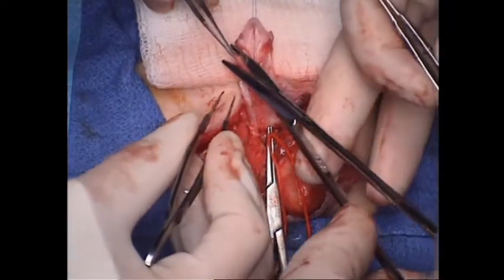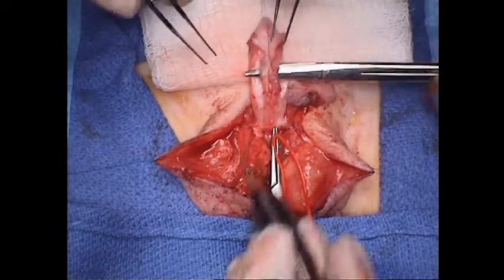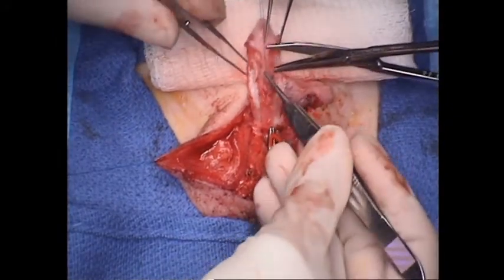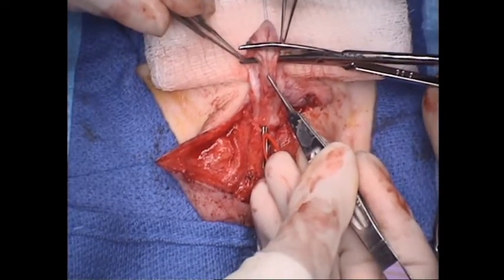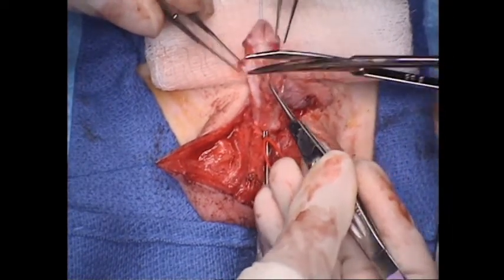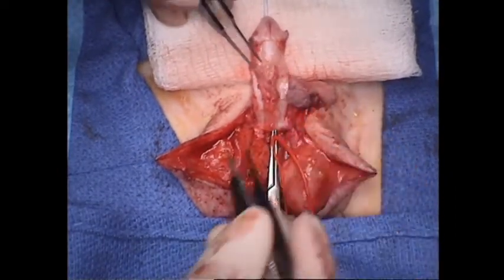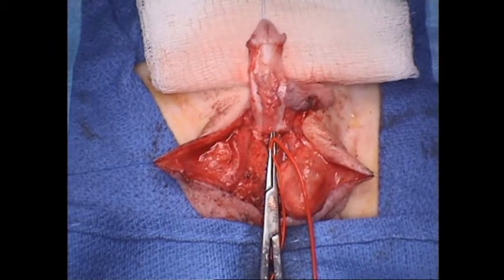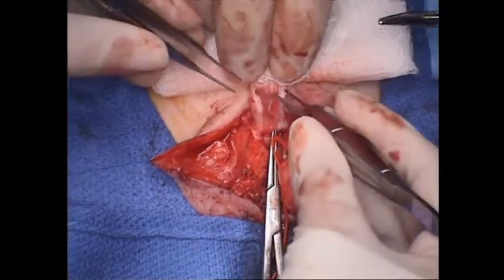And that has not held up with the test of time. And so we do ventral lengthening instead. So see, we have it free. Now we're just going to cut right here at the corona. And that's our free. And you see how that drops. Look at down that. So at least part of his bending was due to a foreshortened urethra and urethral plate.